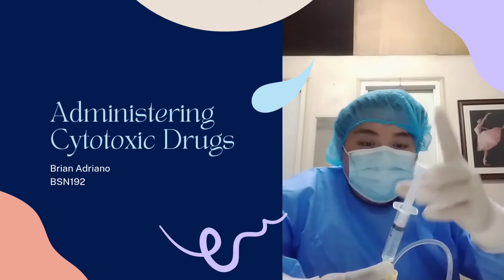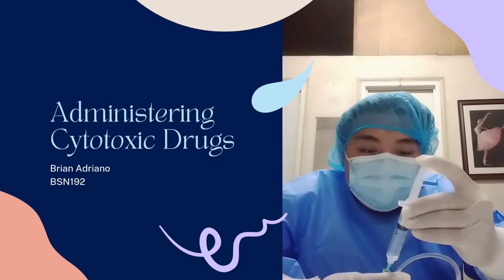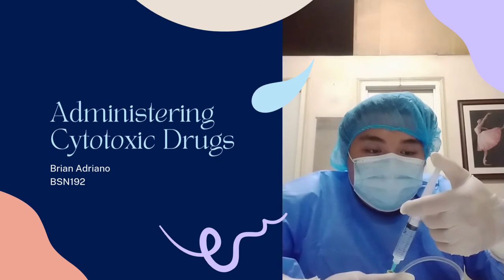Okay, so slow IV infusion, input, push, push, push.